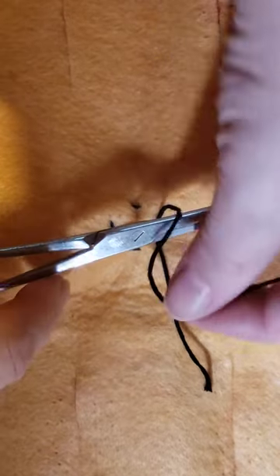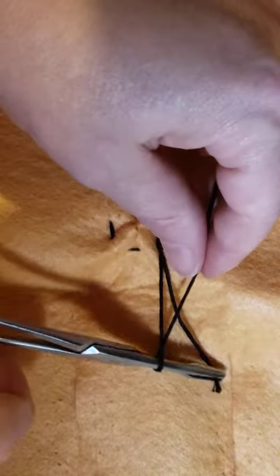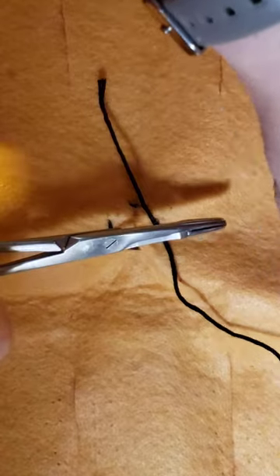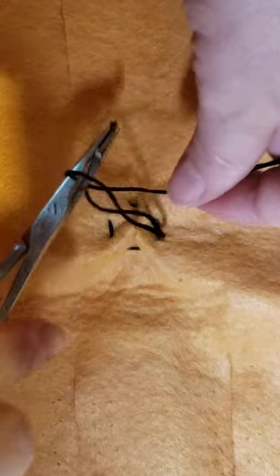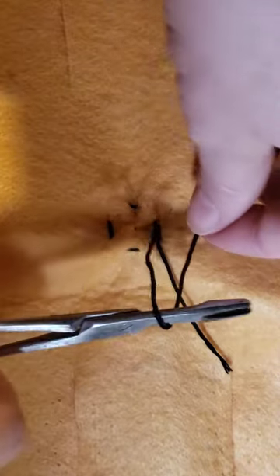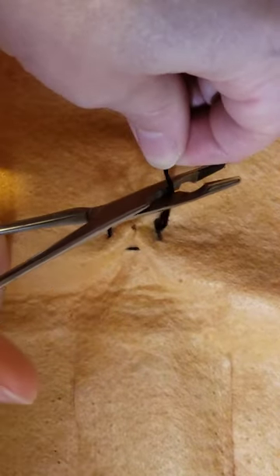Line it back up. Do one more throw. Wrap around your needle holders. Grasp the tail and pull it back through. That was one knot. Go ahead and do one wrap around. Pull it through. That's your first throw of your next knot. Here's your second throw, making that two knots. And then I'm going to go ahead and cut this.